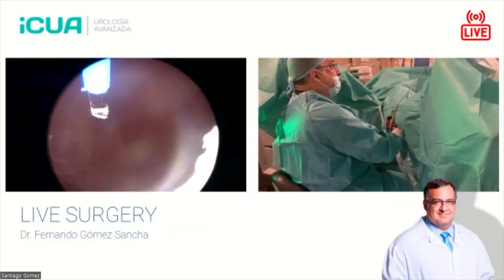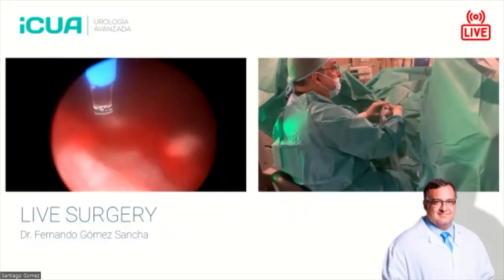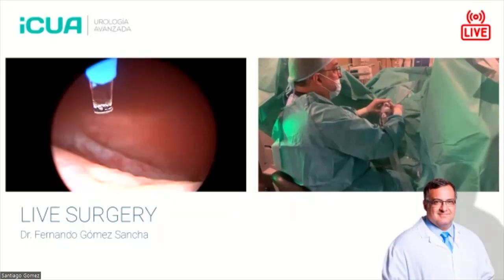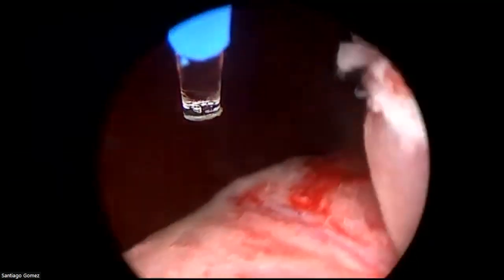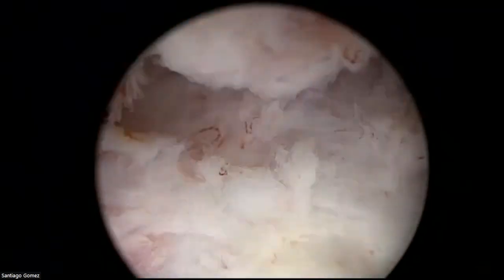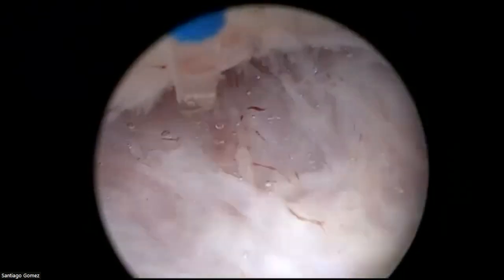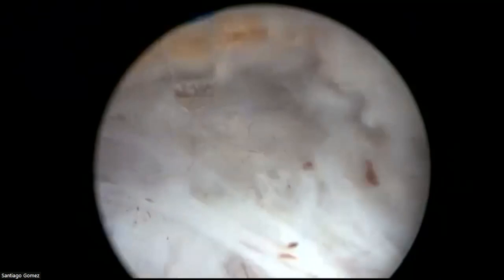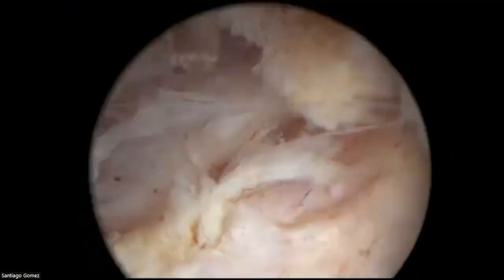Let's see if I can go in. Yes. We saw the UO here, and sorry, I got upwards. I have to go from below if I want to be super safe. Let me advance this a little bit more before we catch the access to the bladder.